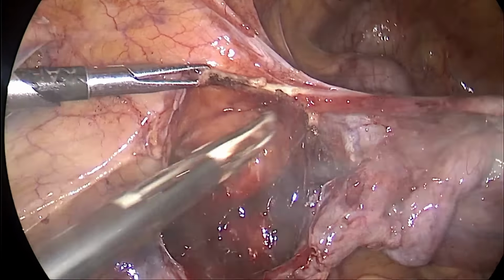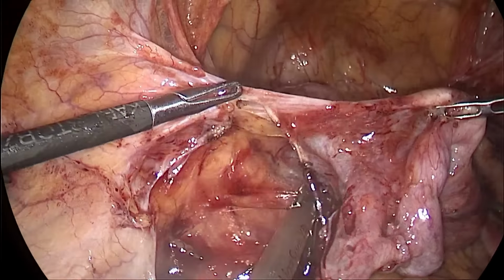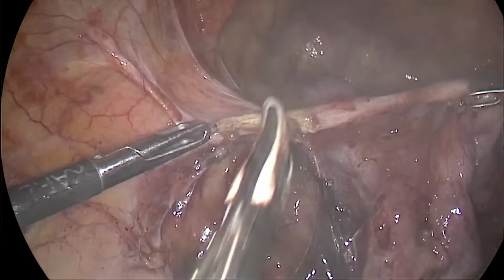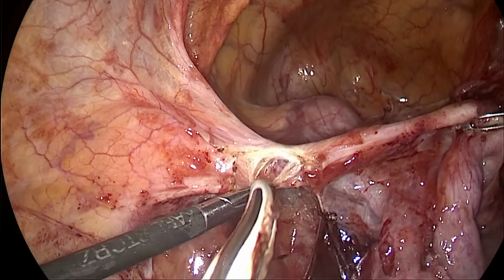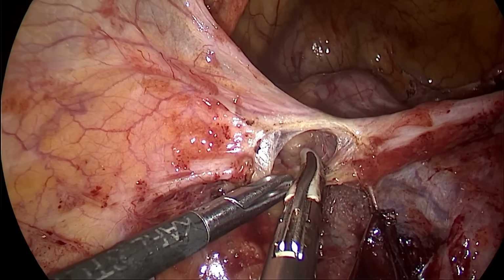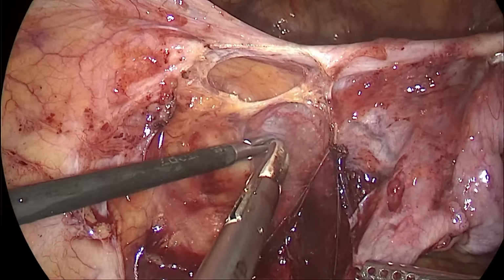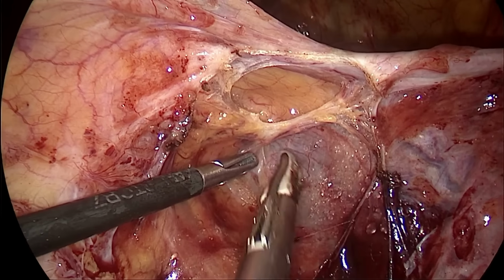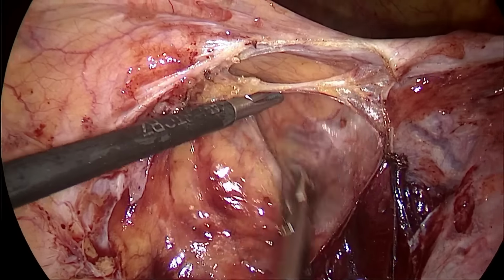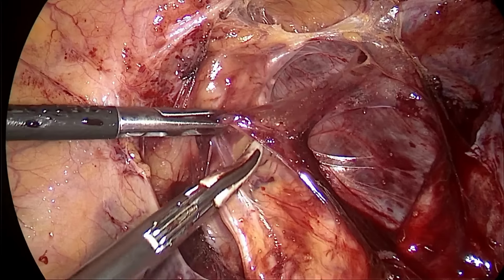Now opening up of the retroperitoneum. Now I am coagulating the round ligament of the left side. Here you can identify, just below my left hand grasper, there is a huge pelvic node, most likely the external iliac group.